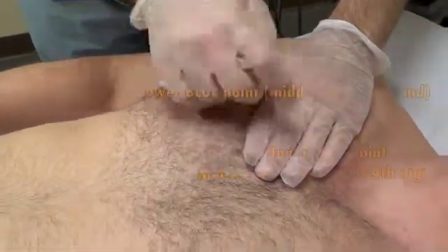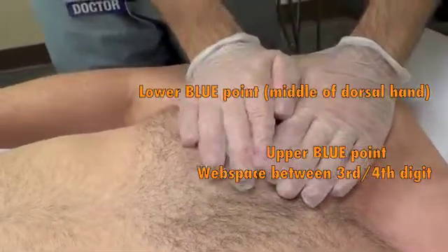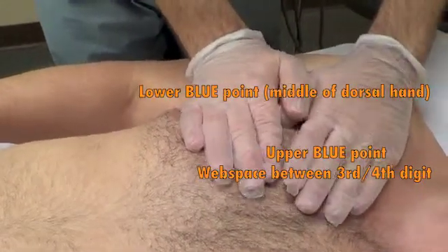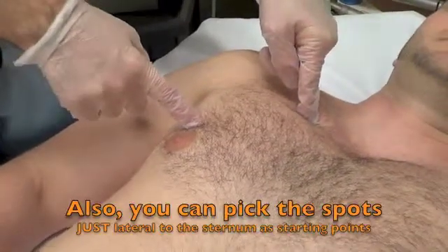In the middle of our ring finger and third finger on the left hand is considered the upper blue point, and the middle of the palm on the right hand is considered our lower blue point. These would be the two points that we could listen from the anterior chest and look with the ultrasound.